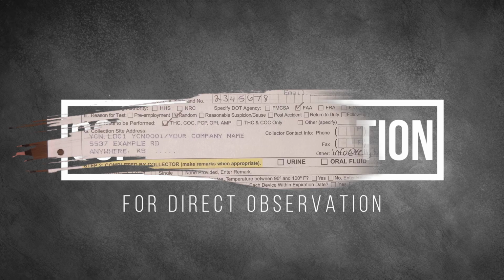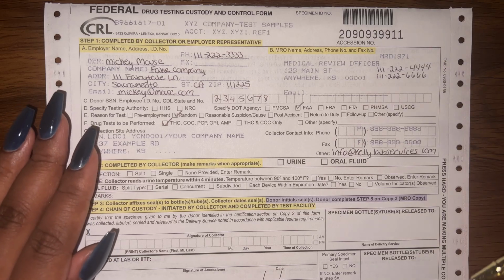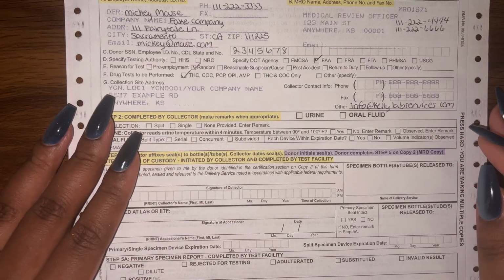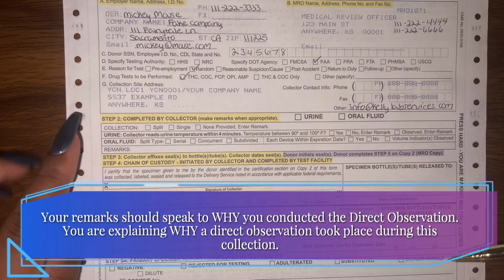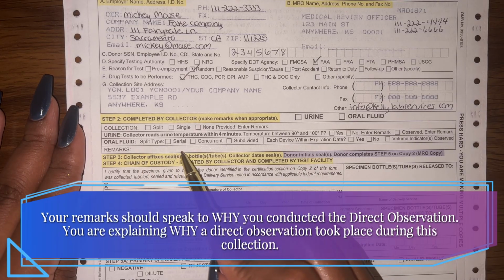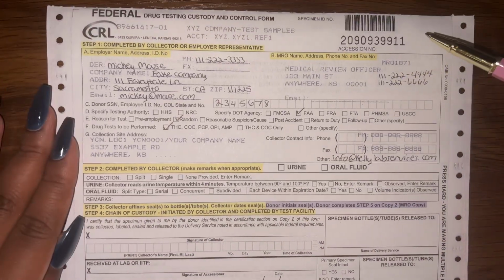Now we have moved on to the direct observation CCF. After you have completed the direct observation with the donor, you must document on your CCF form in step number 2 why you conducted a direct observation. That's what your remark is going to be. You have to explain why you did the direct observation. So this is your second CCF form.